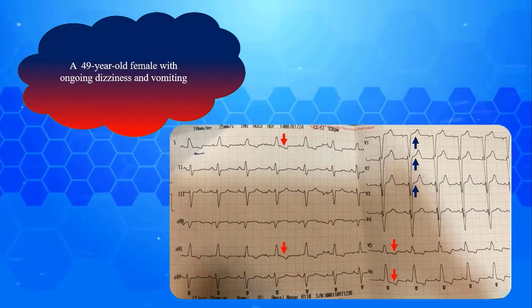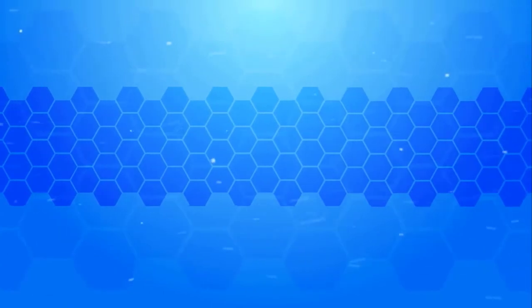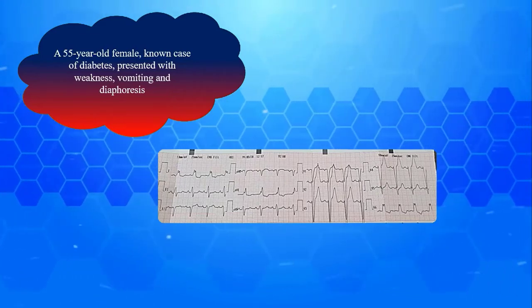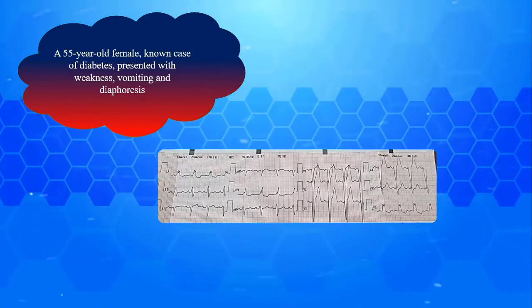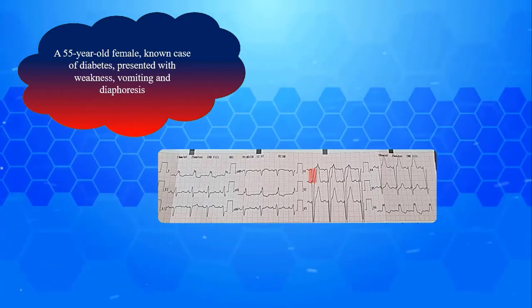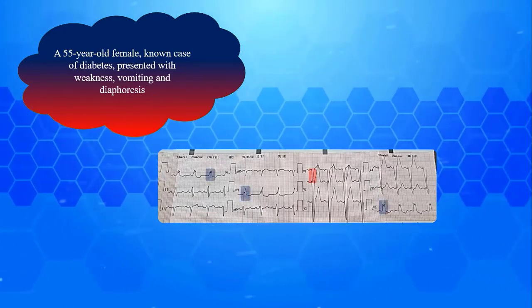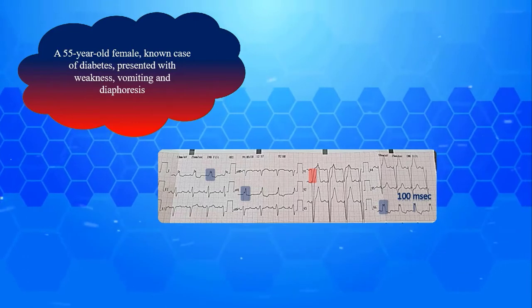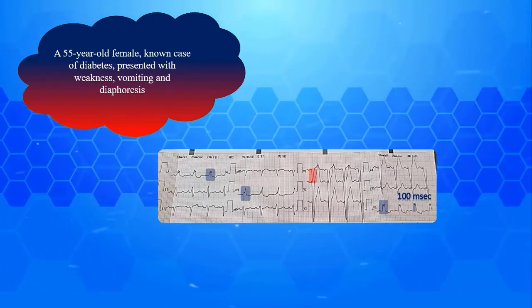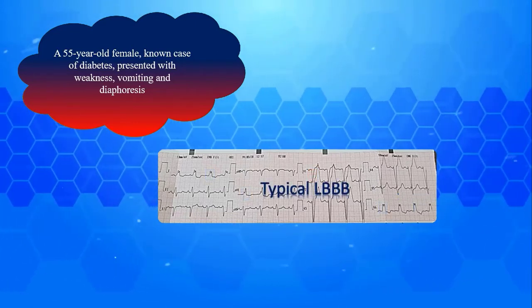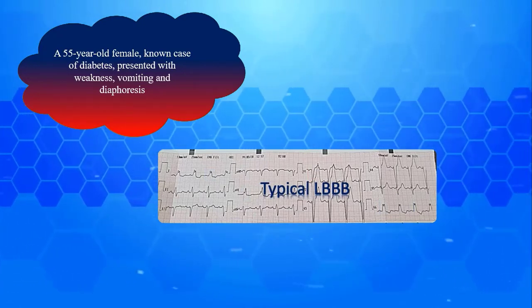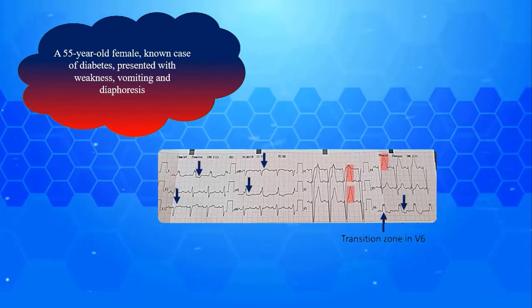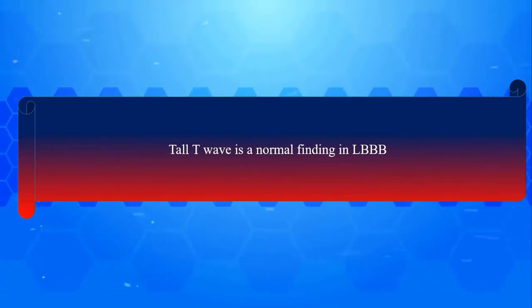Our third strip is from a 55-year-old female, a known case of diabetes, presented with weakness, vomiting, and diaphoresis. Again the QRS complexes are broad with deep S wave in V1 and notched R wave laterally. No septal Q wave is observed in lateral leads. R peak time in V6, D1, and AVL is obviously prolonged at about 100 milliseconds. Therefore this is a typical LBBB. Other associated findings are delayed R wave progression, tall T waves, and secondary STT wave changes. Recall that tall T waves are a normal finding in LBBB.